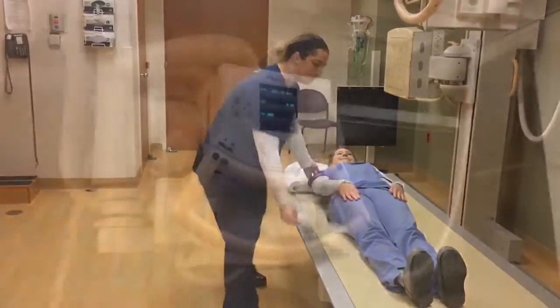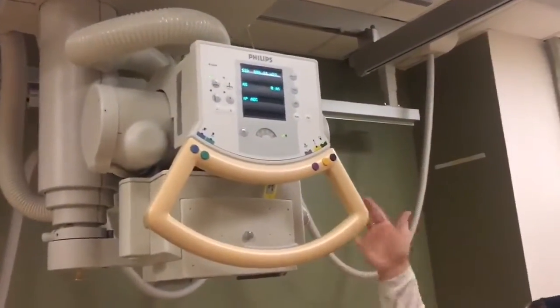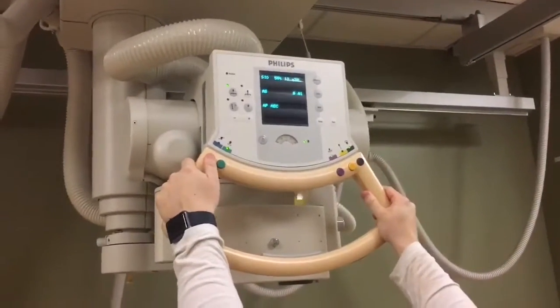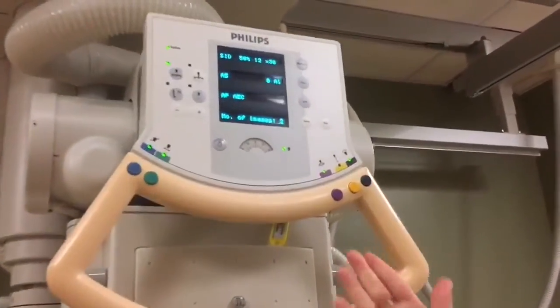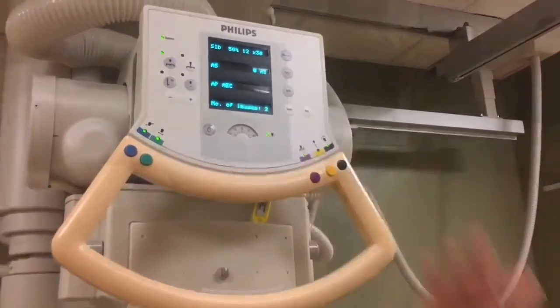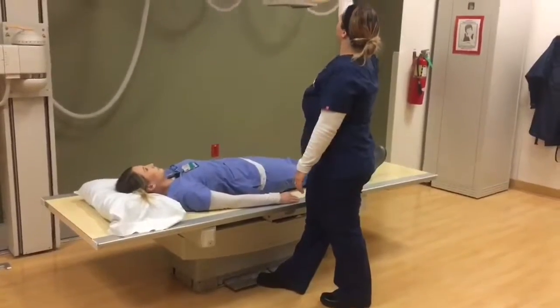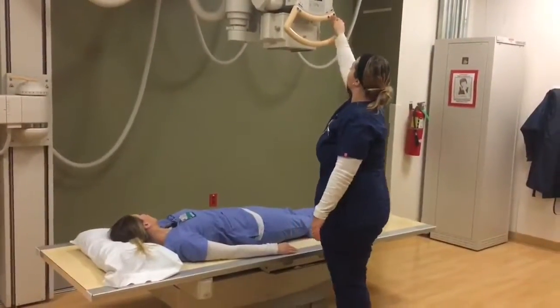Okay. Now I need to put the tube into both detents. I know that it's ready for stitching because it says number of images 2. Some systems require that the table be lowered all the way and the tube head be raised all the way up to allow for stitching.